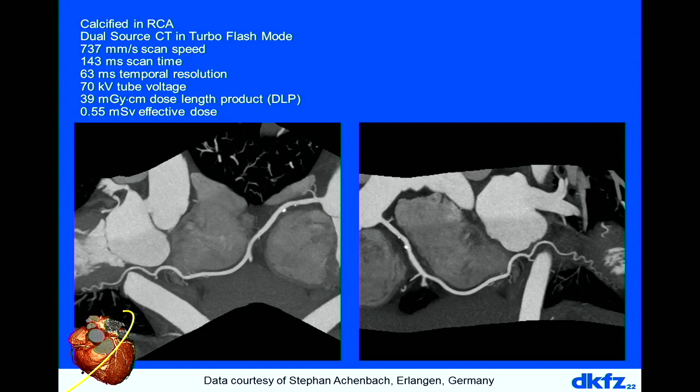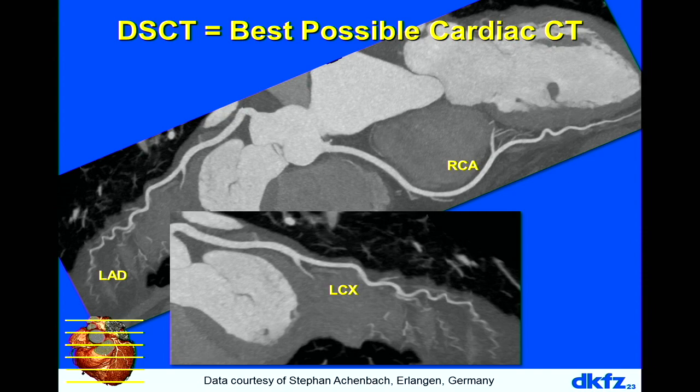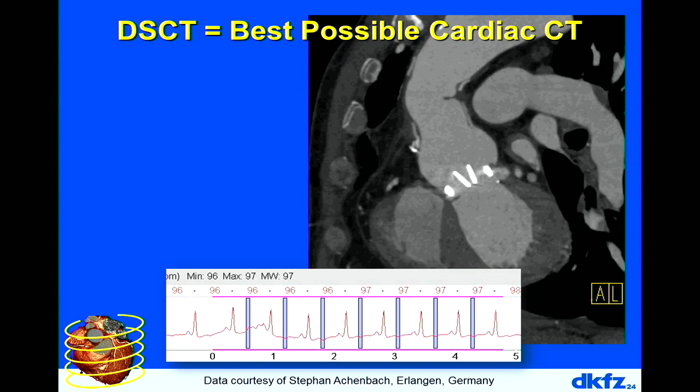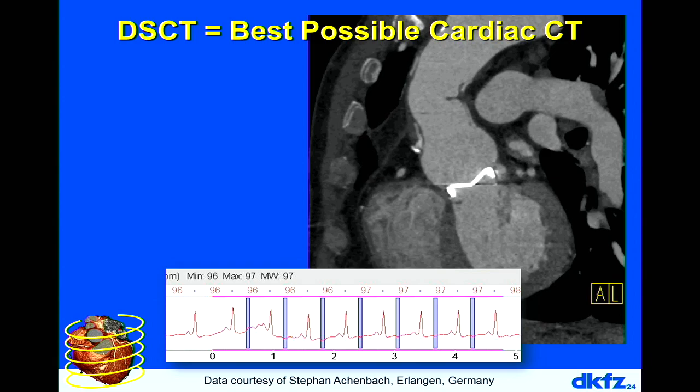Here's another example of a sequence scan — several circles — showing coronaries depicted up to their finest ends, allowing very nice reading of these images. With retrospective gating, you can also see functional studies — for example, an aortic valve to see whether it's working correctly and whether it's been implanted correctly.